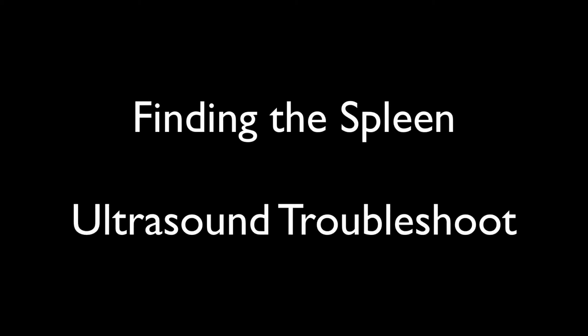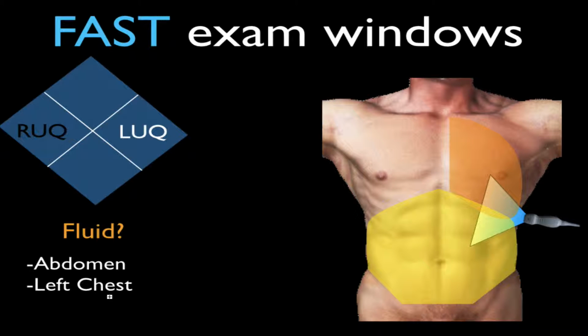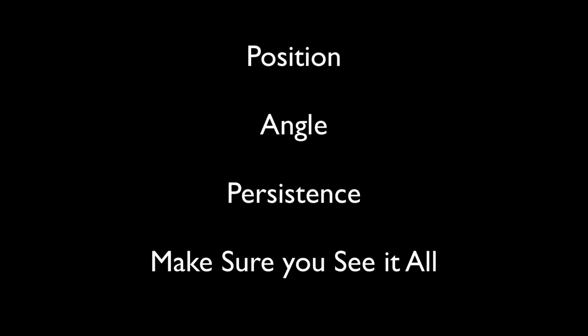The most challenging view of the FAST exam is the left upper quadrant, or the evaluation of the spleen. The mistakes people make are they don't have the correct position, they don't have their hand in the right location, they shoot the ultrasound beam with the wrong angle or in the wrong direction, and they're not persistent enough, because if you're trying to rule out free fluid, you really want to interrogate that spleen in its entirety.